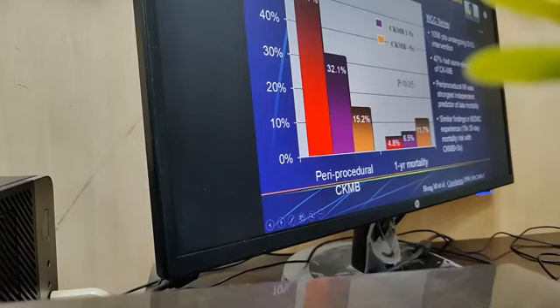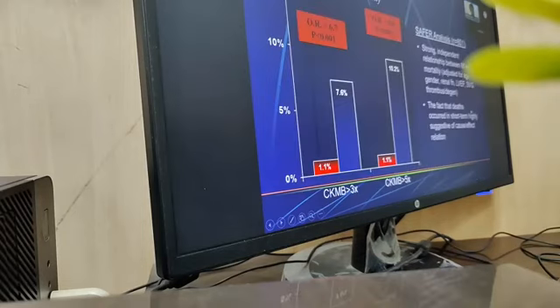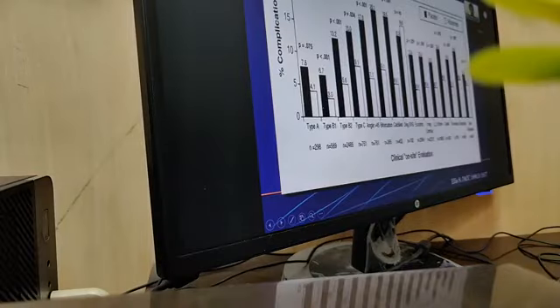Stenting has not completely solved the SVG problem. And this is WCC's data. They showed that 47% had elevation of CKMB. Periprocedural MI was a strong independent predictor of late mortality. The SAFER analysis, which was published in something like 2003 or 2004, showed the strong independent relationship between MI and mortality. If you see in SVG graft, the fact that deaths occurred in the short term is highly suggestive of a cause and effect relationship.